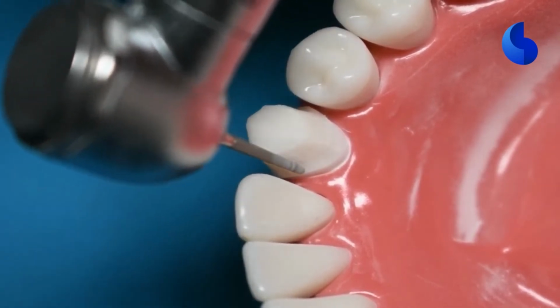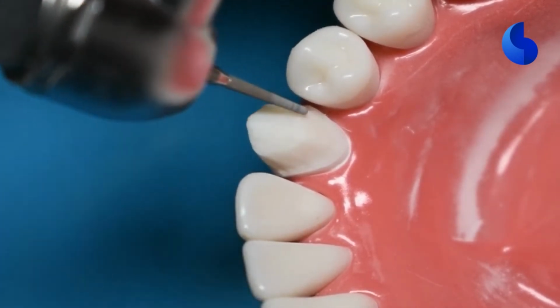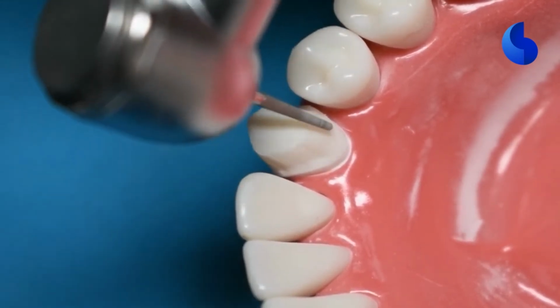Now continue to reduce using this burr, which is our 856-016 burr, and take your burr interproximally so that you can refine the initial preparation that you've done while establishing a millimeter width of a finish line.